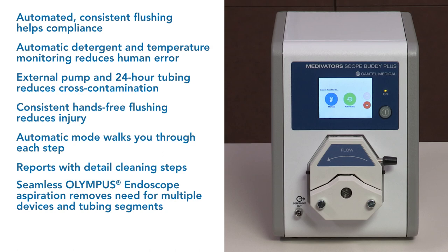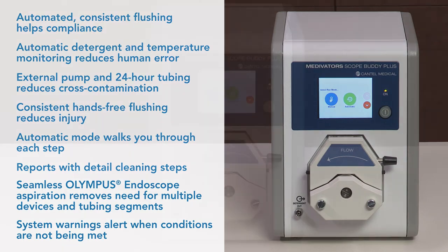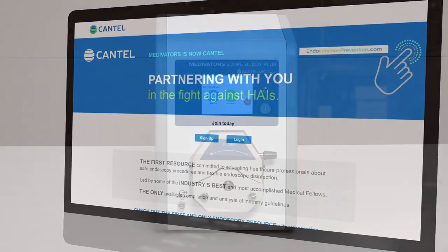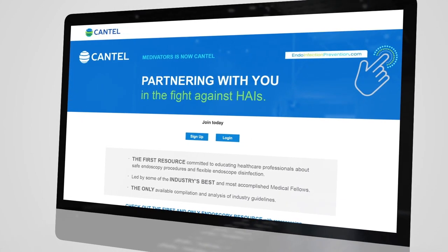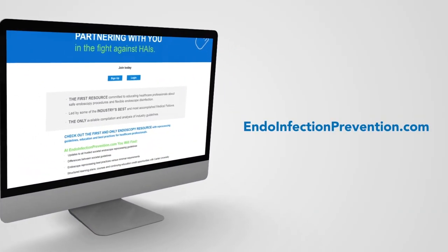Aspiration for Olympus endoscopes is performed seamlessly without the need for multiple devices and tubing segments, and is automatically documented in the data log. System warnings alert you when specifications are not being met and document those instances. This machine is designed and engineered to meet society guidelines and recommendations, providing infection prevention for your patients, caregivers, and other healthcare providers. Additional details for specific guidelines are available online at endoinfectionprevention.com.